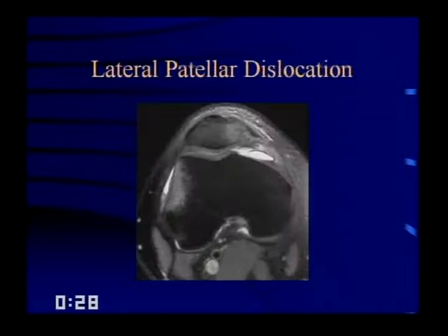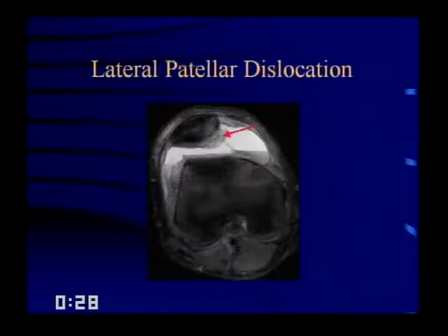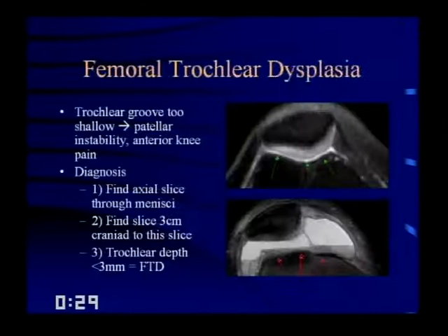The patella jumped out of the trochlear notch, impacted against the lateral femur, and popped right back when the patient stood up — leaving classic bone bruises and tearing of the medial retinaculum. Look for osteochondral injuries. Here's a nice example: this person has a hemarthrosis with a hematocrit level. Relatively normal cartilage on the lateral facet of the patella, but the medial facet cartilage is all disrupted. This patient also had an osteochondral fracture.